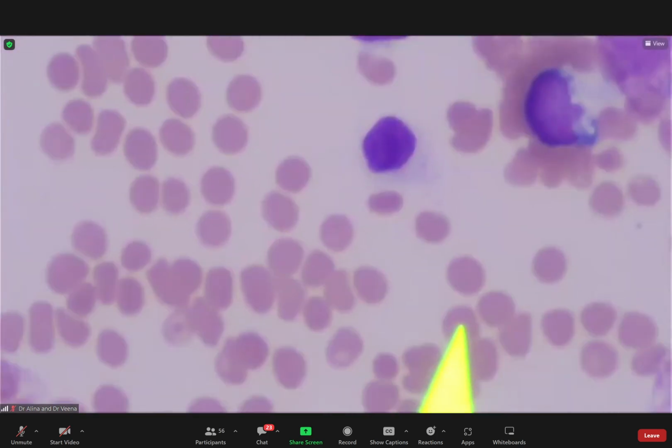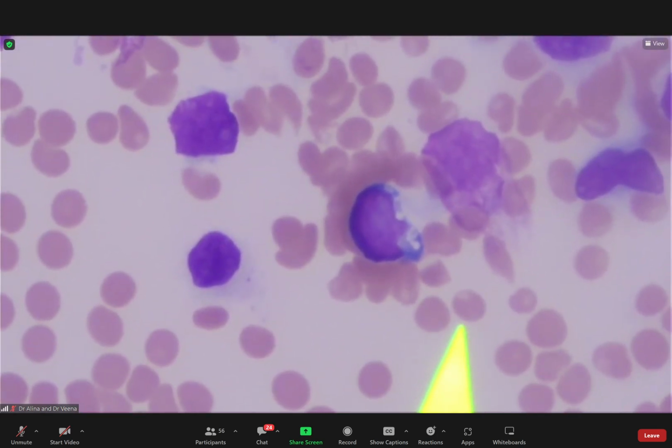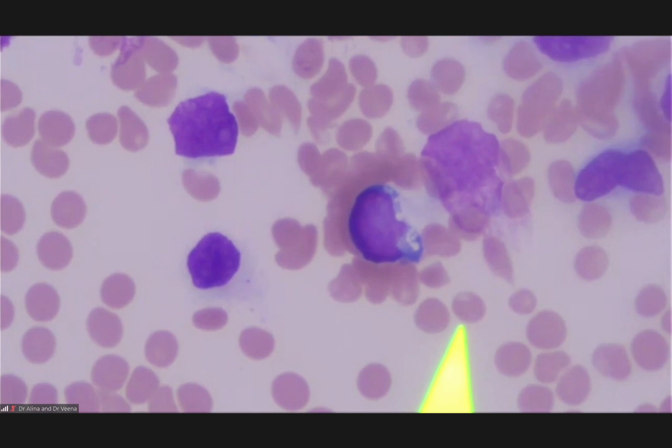Okay. And some of them have these. I don't know whether you were fortunate enough to be able to spot these cells, but these blasts have vacuolation. Okay. I hear a collective sigh of, I'm not sure whether it's disappointment or agreement, or realization, a collective sigh of realization that now you are dealing with a Burkitt case.